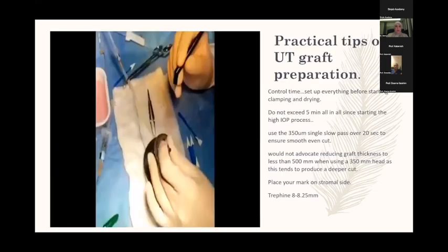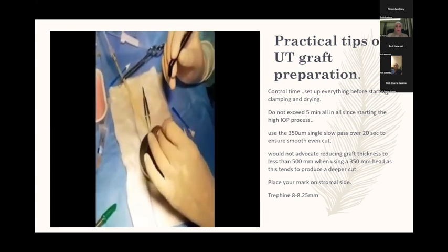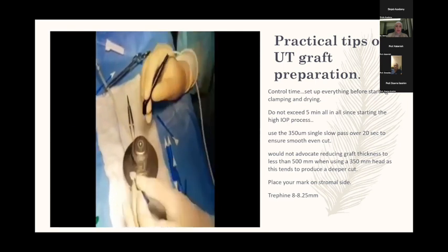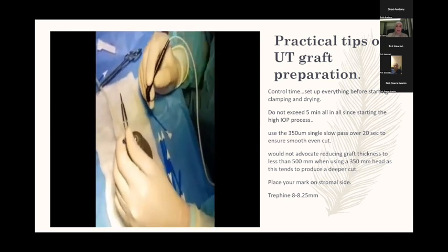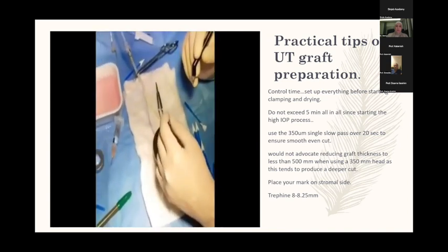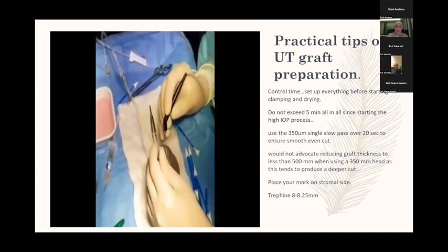Now, this video will show how, after removing the epithelium, I use the alcohol spear for almost 1 minute, and then I measure the thickness of the cornea using a pachymeter. Now, the alcohol's role is to dry the cornea, to thin it a little bit. If you have a freshly cut cornea, usually I don't use it for a long time.